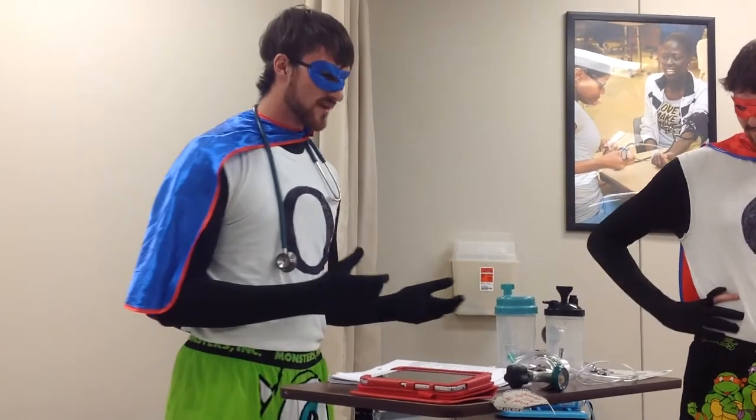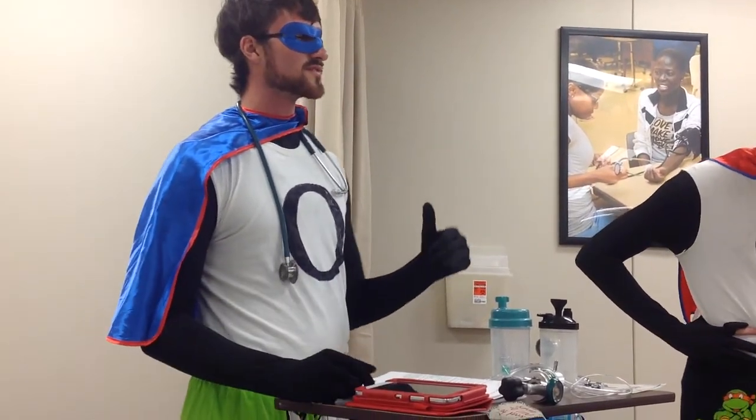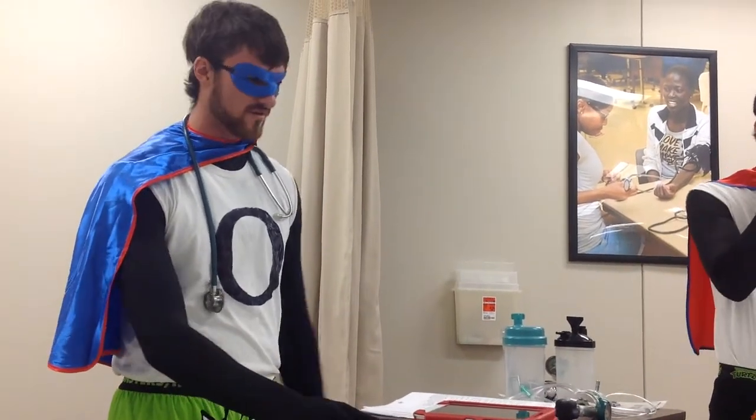The situation is you receive your doctor's orders, and your doctor's telling you that you need to give your patient oxygen. So, first of all, oxygen is a medication because it has a dosage, and putting too much or too little oxygen in your patient can affect their outcome.